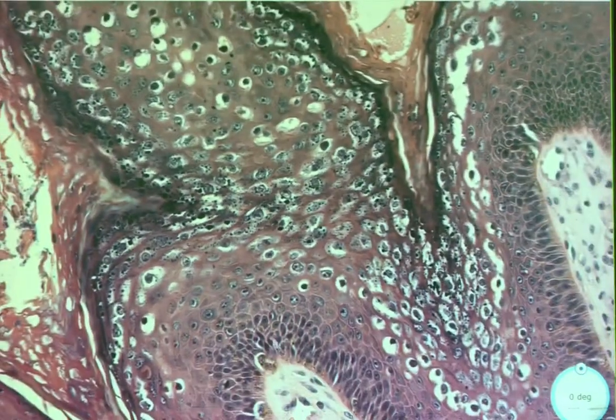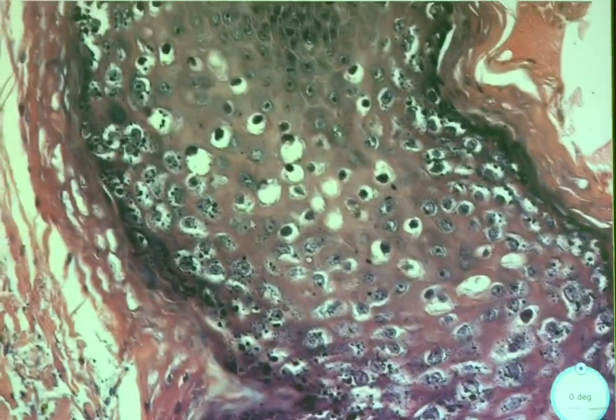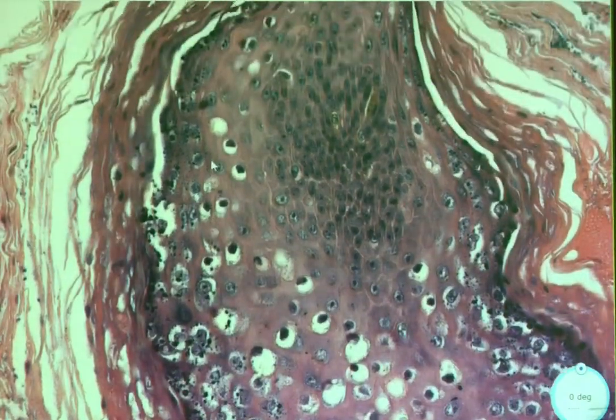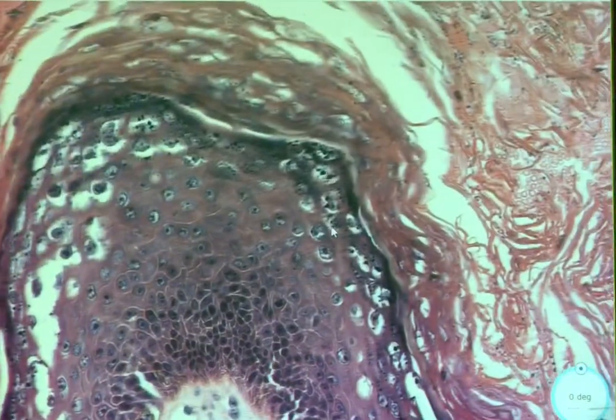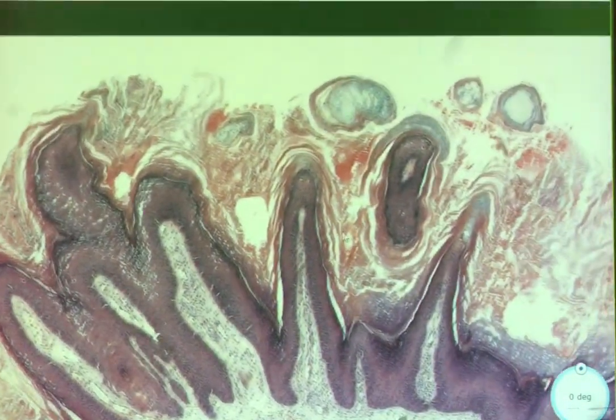So if you look at the epithelium here, these cells don't look right. They're not maturing properly. They got all the way up, and they still look really big, the nuclei. The nuclear features are not projecting as well. This might be a double nuclei. That's never a good sign. It's atypical, so that's another feature. There are some dysplastic looking epidermal features here.